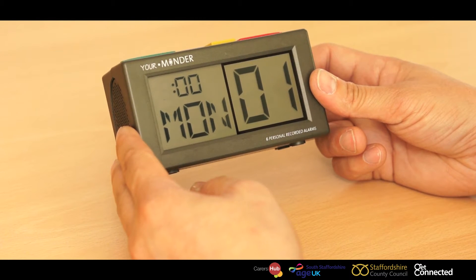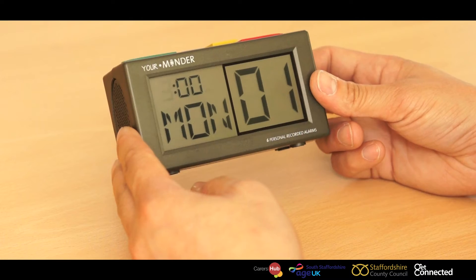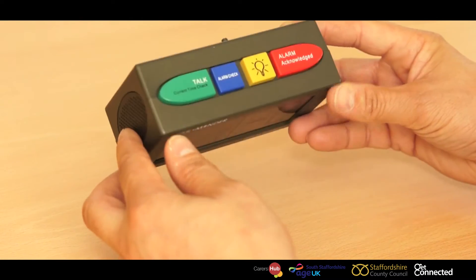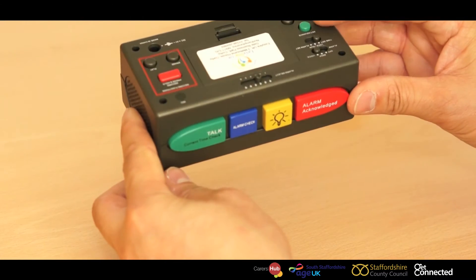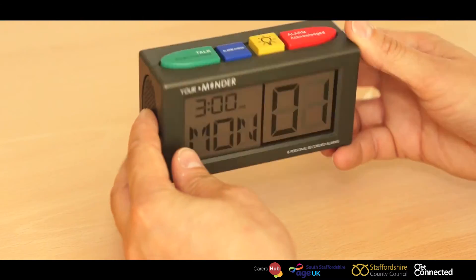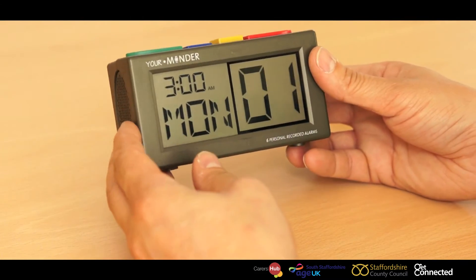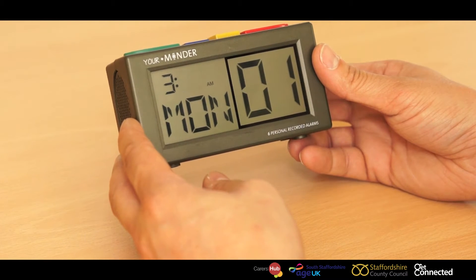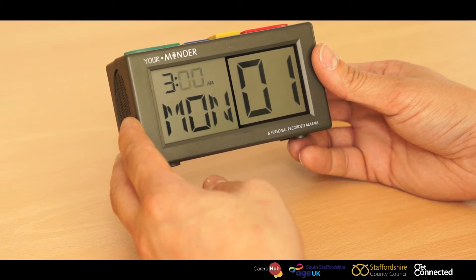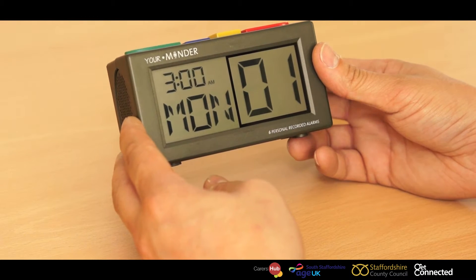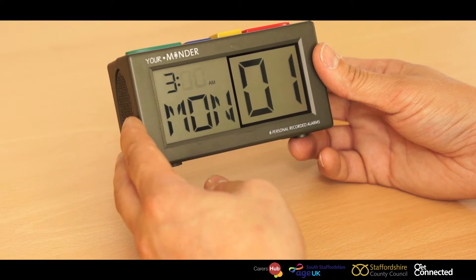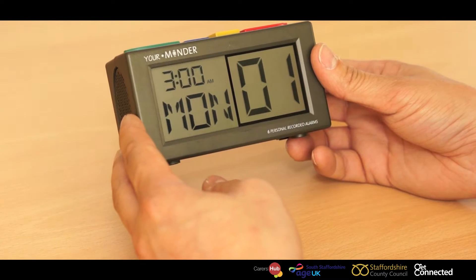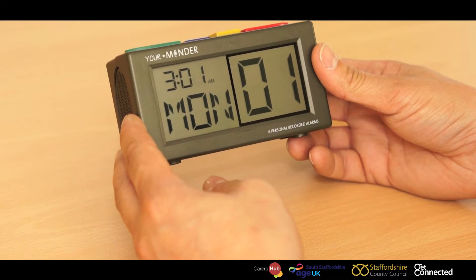Once you've reached the appropriate hour, you now push the green set and advance button again. That will then advance to minutes. We then use the up and down or plus and minus button to advance through the minute options.